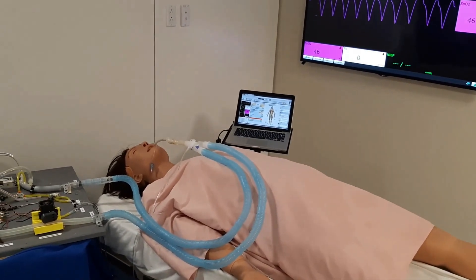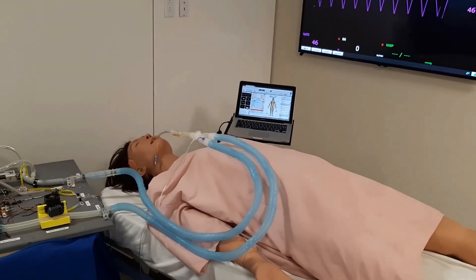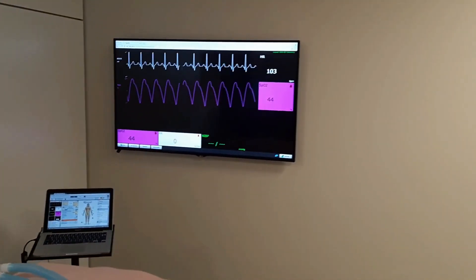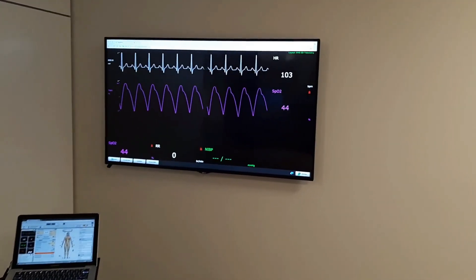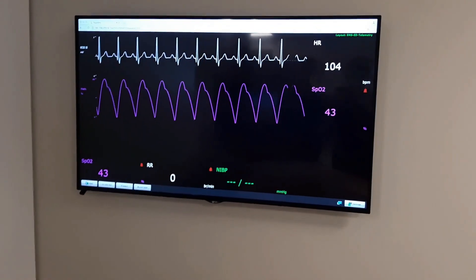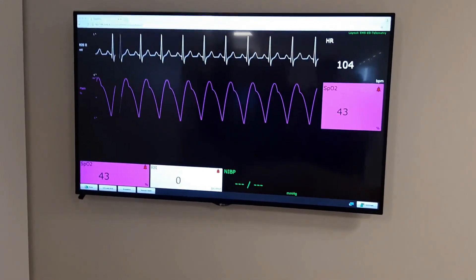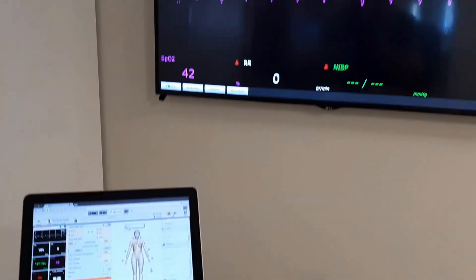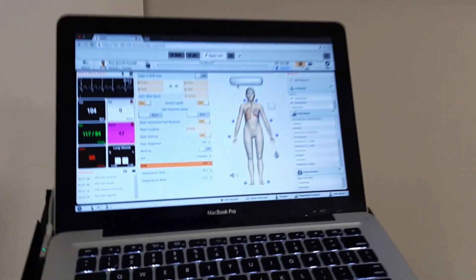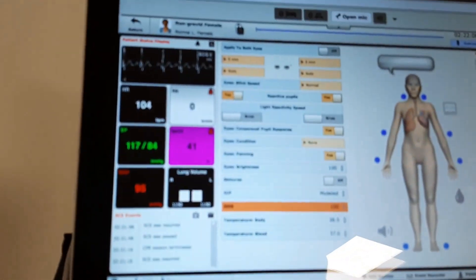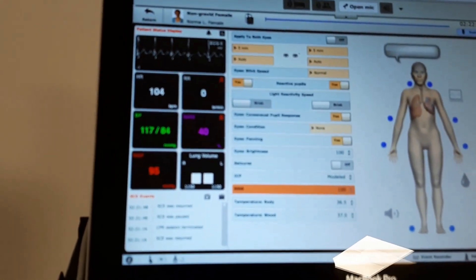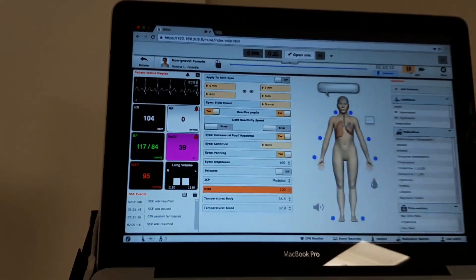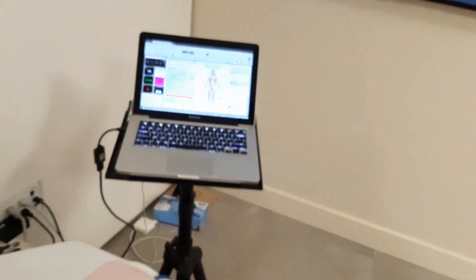Our prototype ventilator is connected to an intubated CAE patient simulator. The patient is currently in apnea with no chest rise or fall. On the patient monitor, we can see a respiratory rate of zero and a dropping SpO2, so this patient definitely needs ventilation support. There's also no lung movement as indicated by the sensed lung volume.